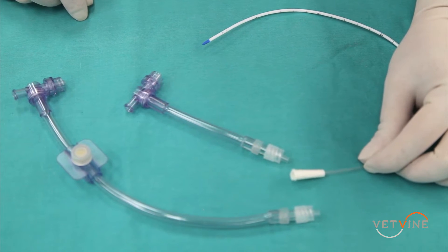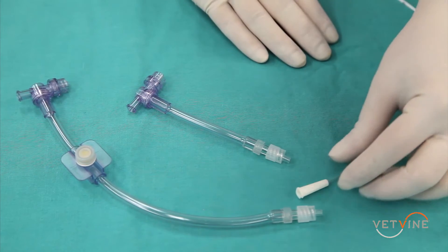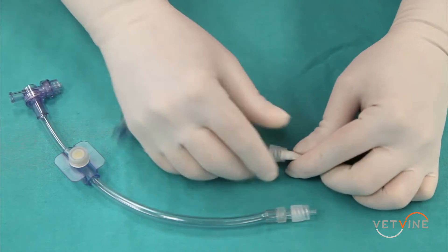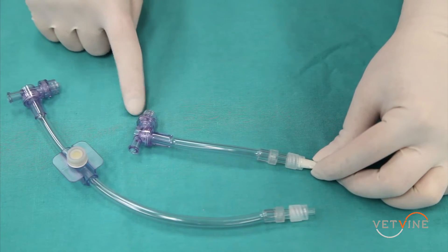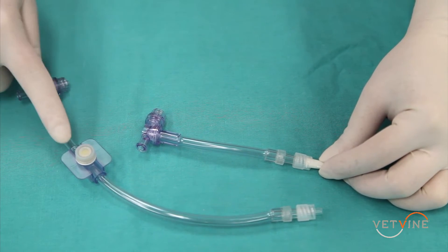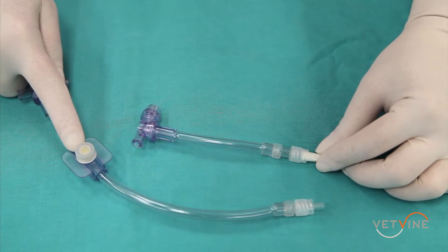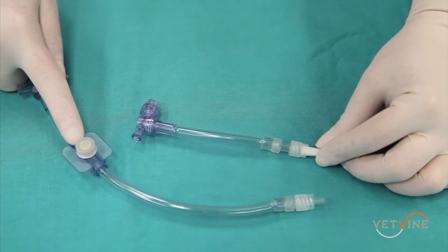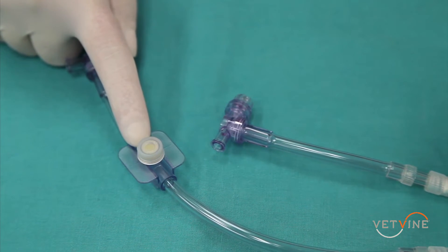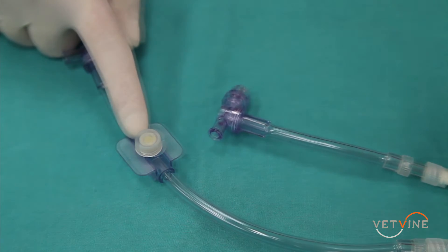The centesis valves come with and without an injection port. The valve is secured into place with the luer lock adapter and can be used to suction fluid or air from the patient's thoracic cavity. A benefit of using the centesis valve with the injection port is that one can instill lactated Ringer's or warm sterile saline to lavage a pyothorax, or it can be used to instill local anesthetic such as bupivacaine or lidocaine in a patient that is having pleural pain.